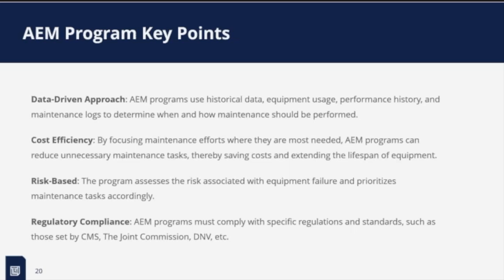It is risk-based. That's going to be a factor in that. For high-risk equipment, you want to really make sure you're doing the right thing. I would say most people are putting their non-high-risk equipment in the AEM strategy; there's more non-high-risk equipment in it than high-risk equipment. But like I said, you can put high-risk equipment in, and then also you want to make sure you're compliant.